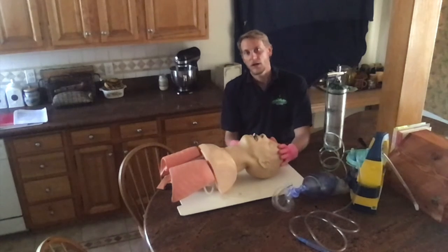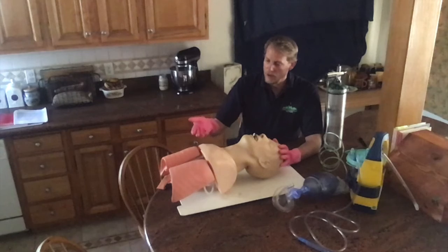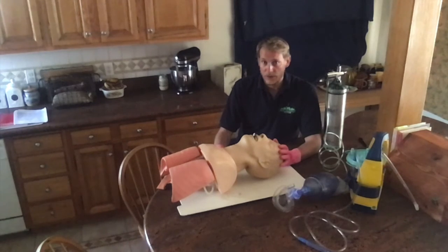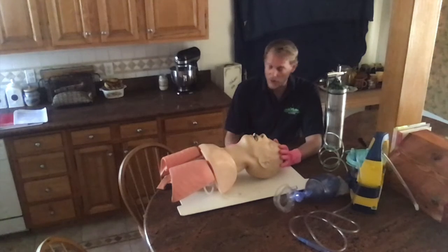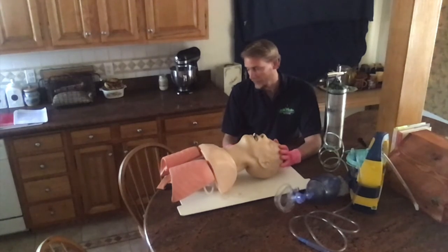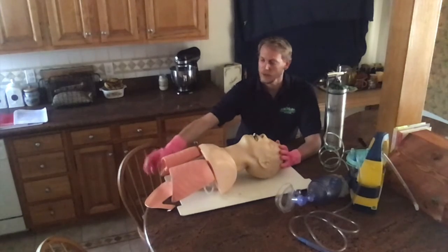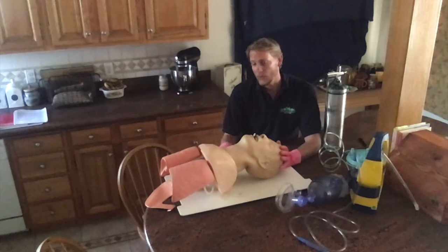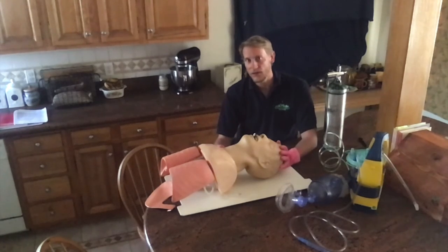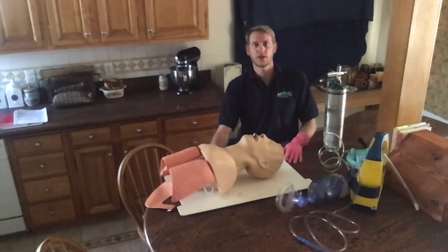I know I was administering ventilations appropriately because I saw equal and adequate rise and fall of the chest. I also had a nice tight seal around the patient's nose and mouth with no air escaping. Because it's a mannequin, I could confirm the stomach was not inflating, indicating an open, patent airway with air going into the lungs appropriately. That concludes BVM ventilation of an apneic adult patient.